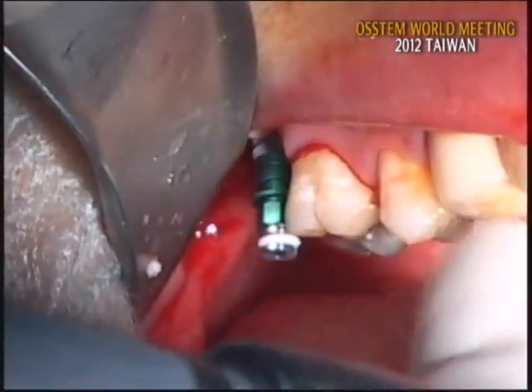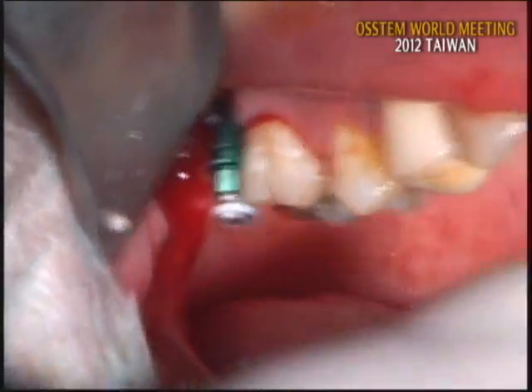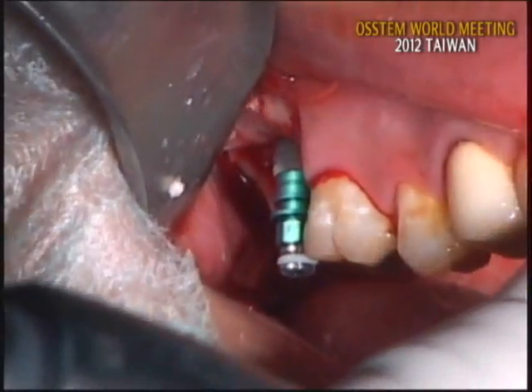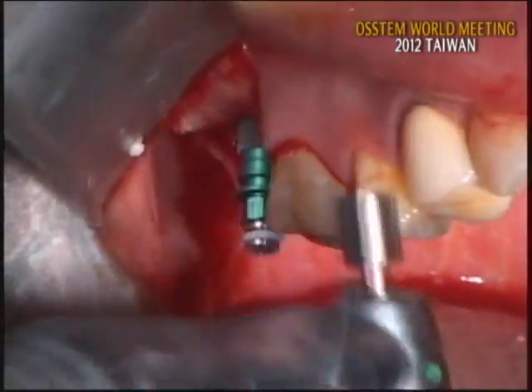Light close, please. Close, slightly close. Light close. Okay, I checked the path. Okay, it's good. Open, please. Okay, let me finish.